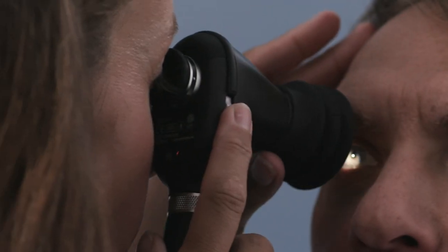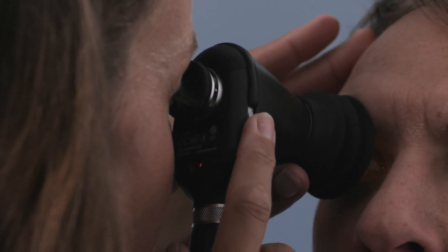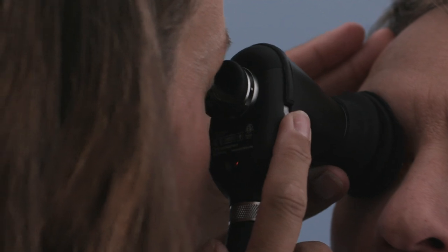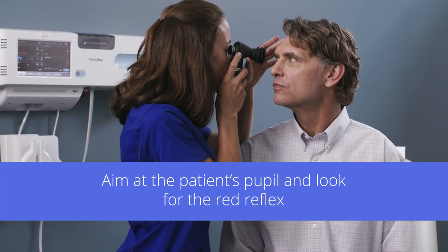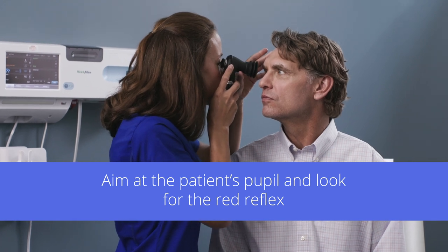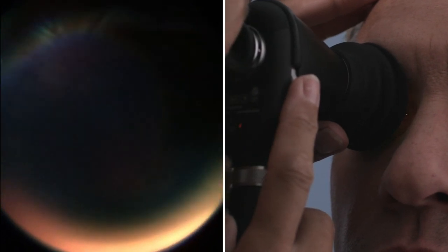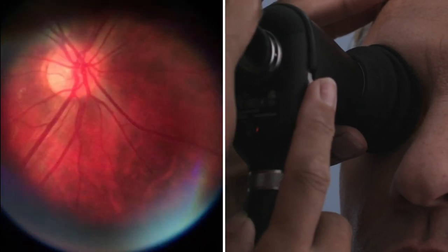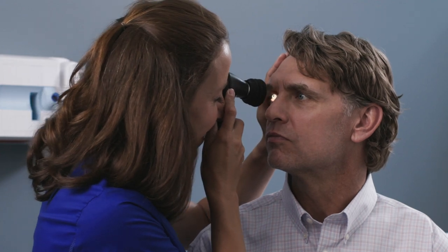You may want to use your opposite hand to brace from the patient's head to the front of the scope. This technique can help with stability and precision. Focus on the patient's pupil and look for the red reflex. Slowly follow the red reflex toward the patient and into the pupil until you're about an inch from the patient's eye, or when the eye cup compresses slightly against their brow. If you lose the image, pull back slightly and then approach again.